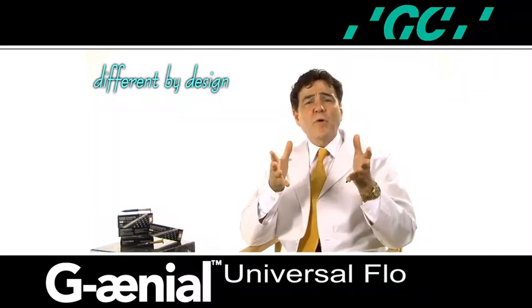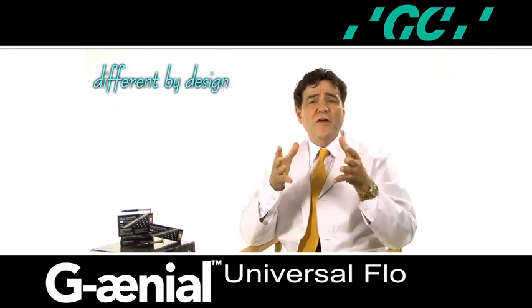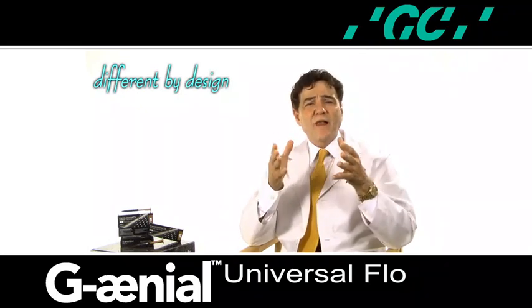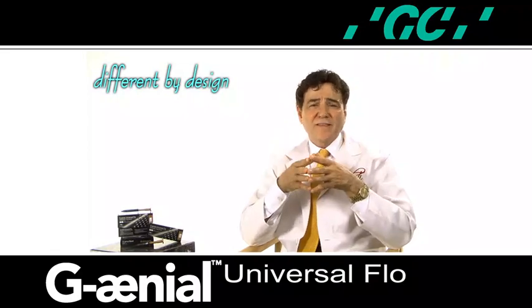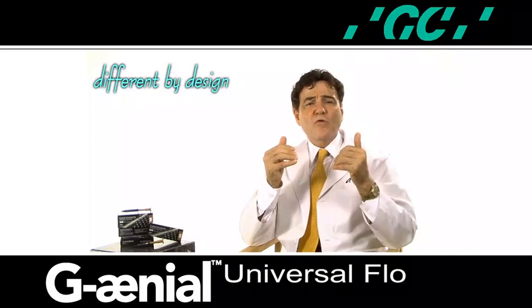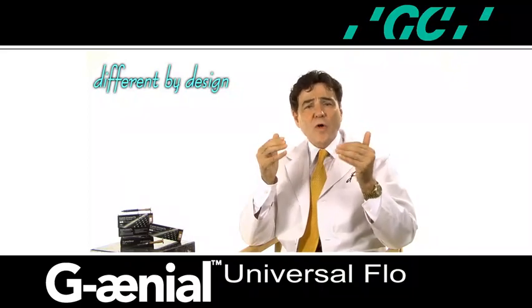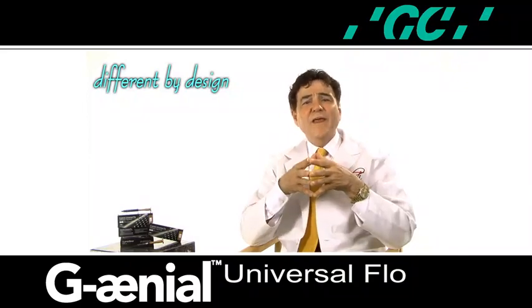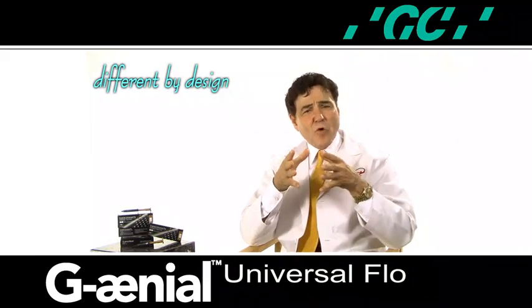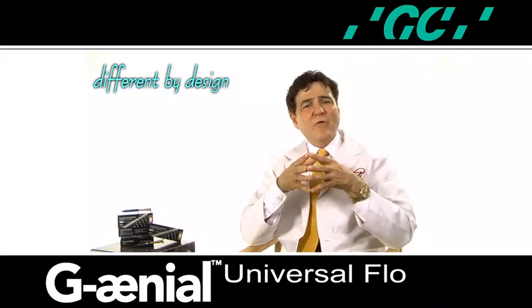This reversible and prepless technique can be used by the interdisciplinary team as a diagnostic guide for establishing and developing the final restorative and aesthetic parameters. In some cases, these transitional restorations can be worn for months or even years by patients during interdisciplinary treatment. This process can be performed intraorally without the need for anesthesia.